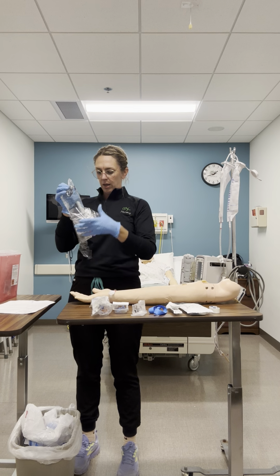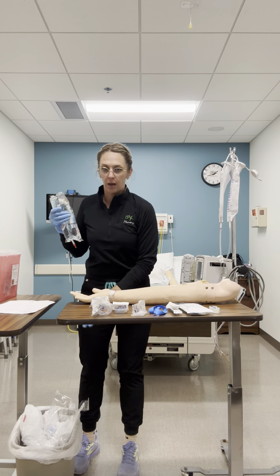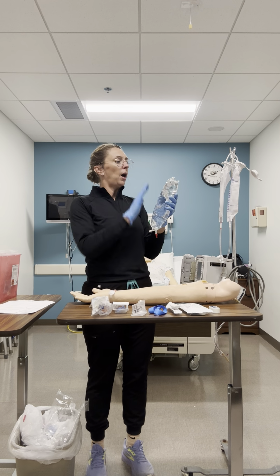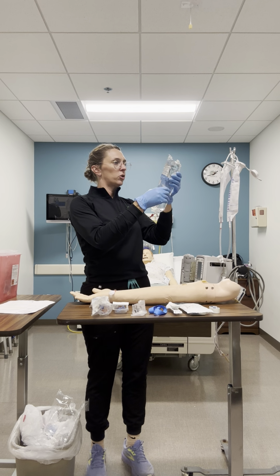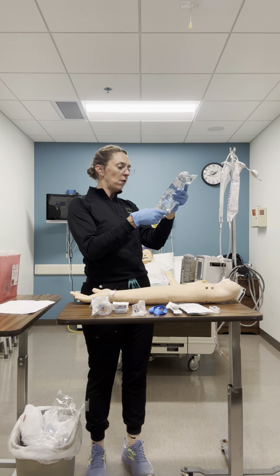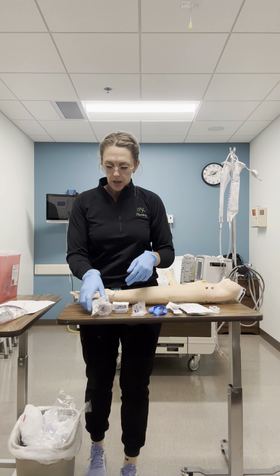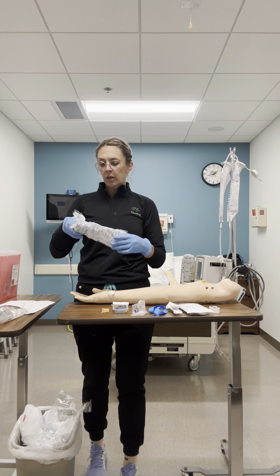Now I'm going to go ahead and open my, I wouldn't push that into the trash, but the trash needs to be thrown out. I'm going to open my saline. I'm going to look at it and I'm going to kind of squeeze it carefully, make sure there's no leaks, make sure there's no holes, make sure it's clear, there's nothing floating in it, and it is not expired or discolored. Everything looks really good with this, and it is the right thing. So we're going to go ahead and we'll set that aside, and I would open all of my IV tubing.